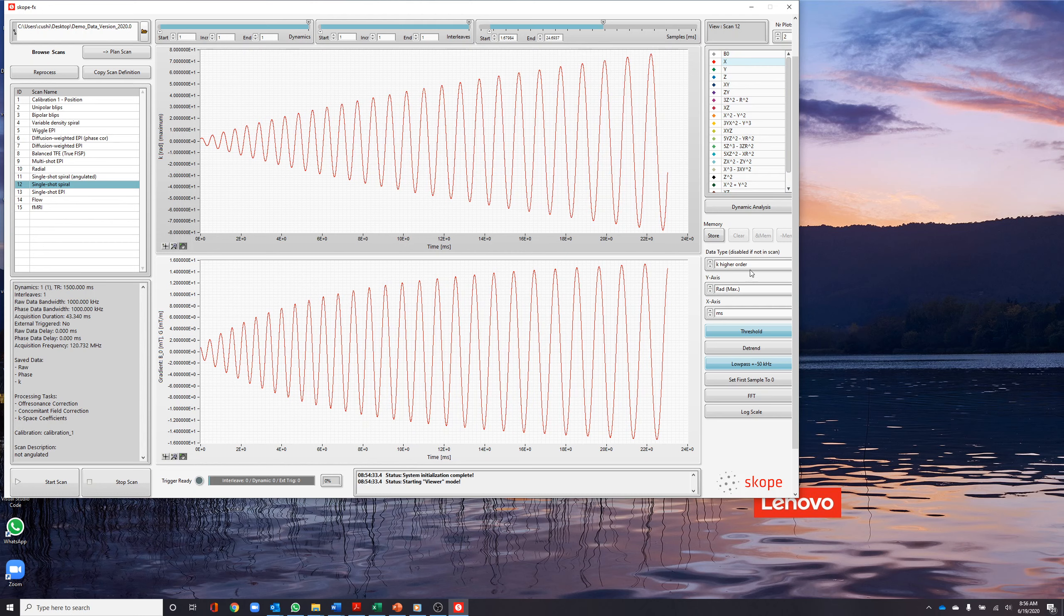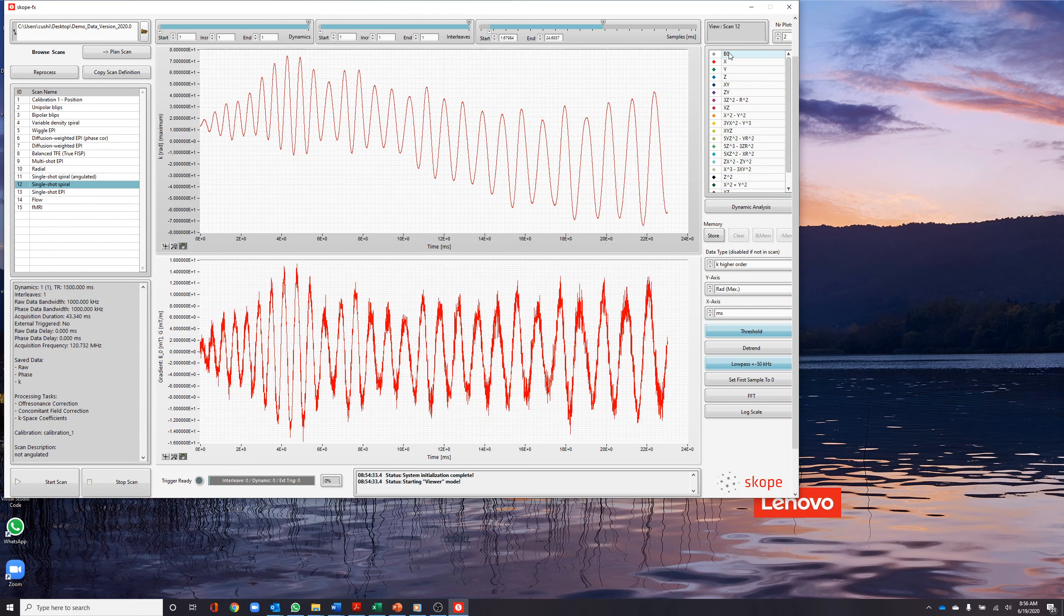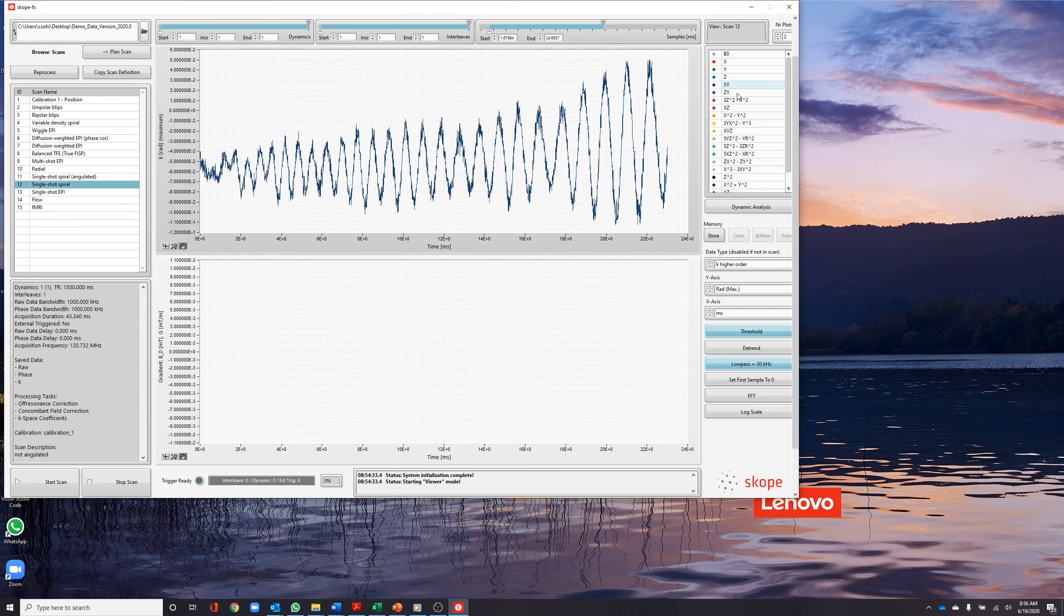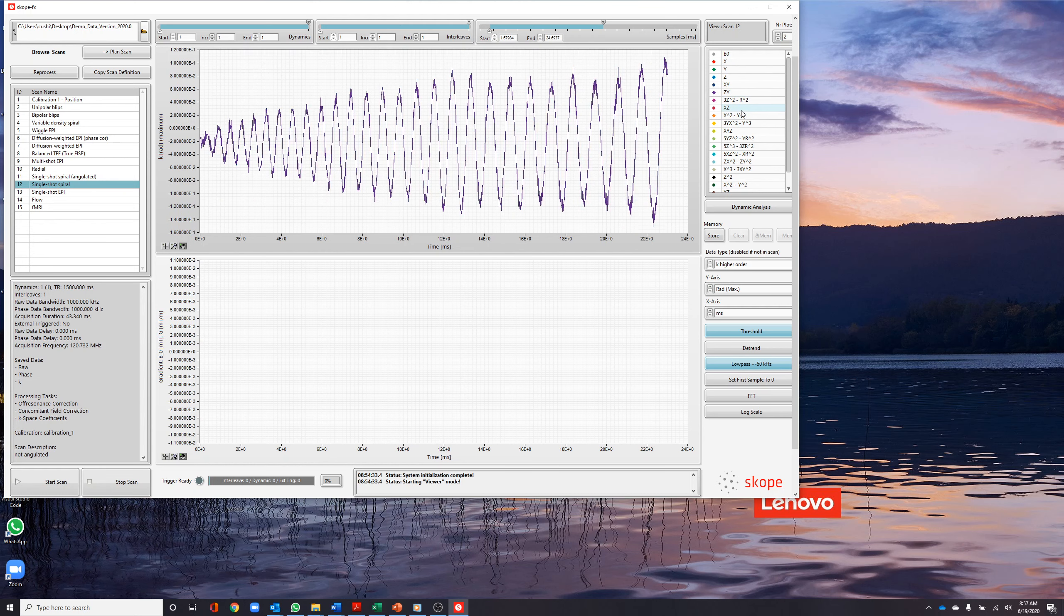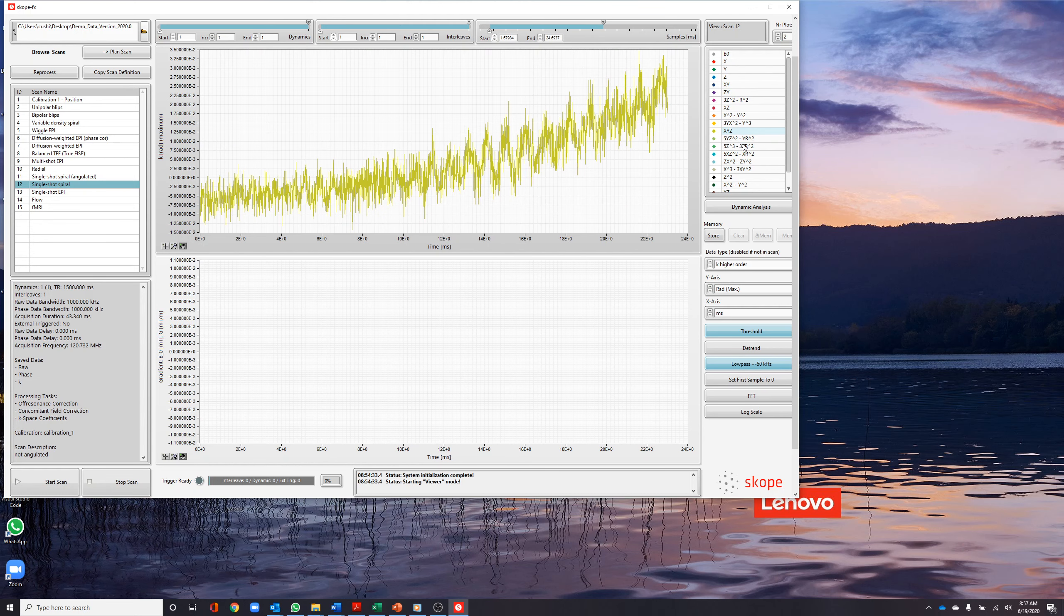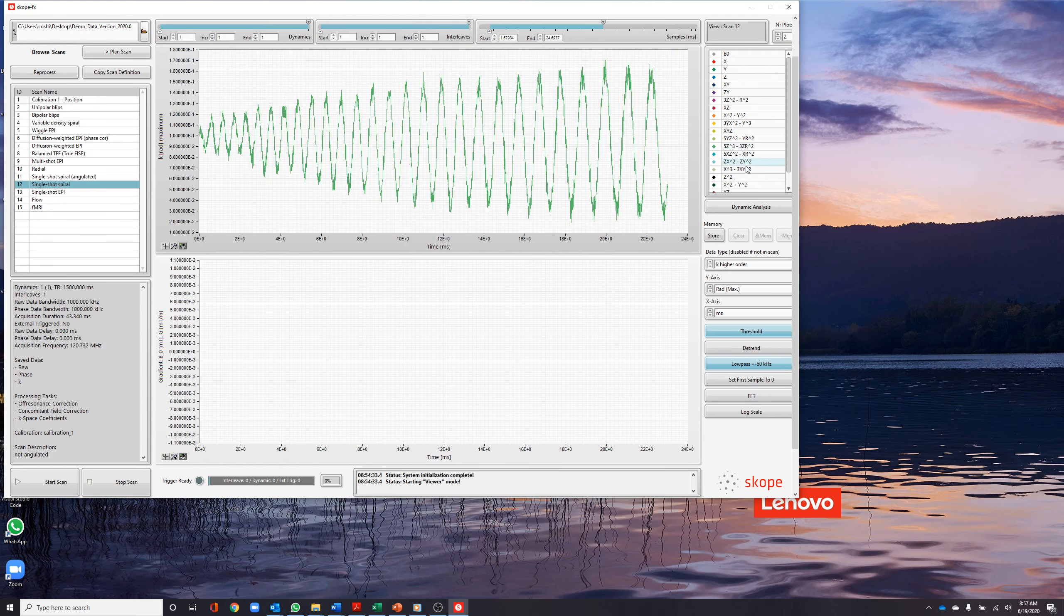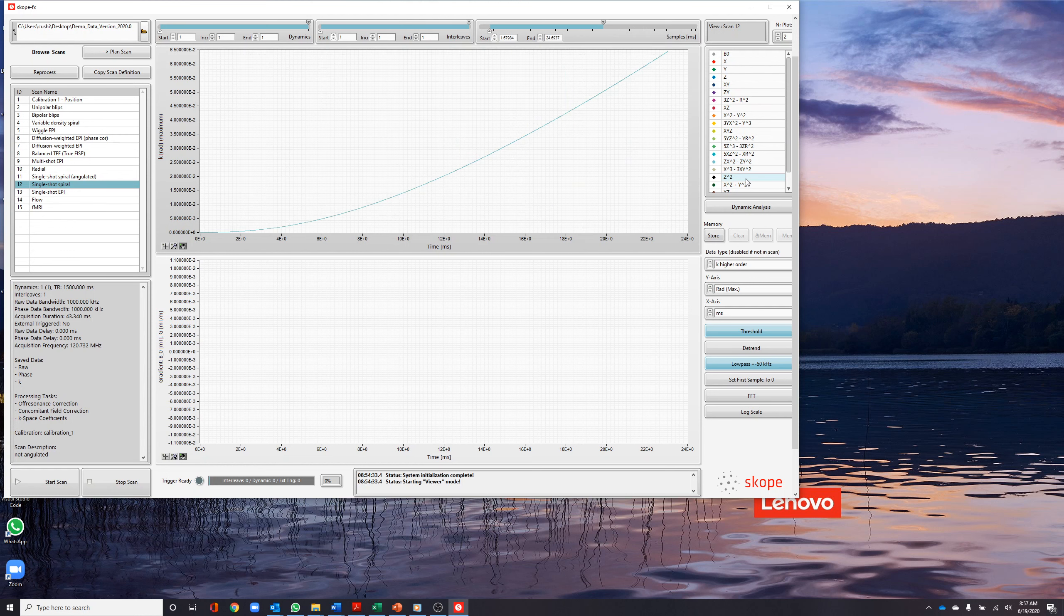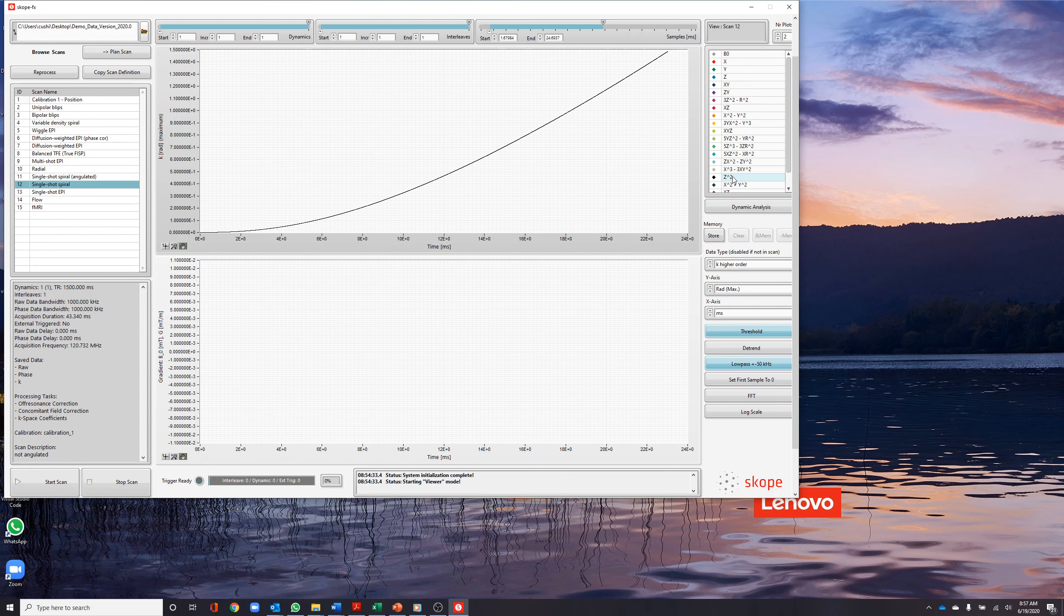B0 field fluctuations can be seen by selecting the B0 channel. Higher-order terms can be visualized by selecting k higher-order. Higher-order terms are a result of concomitant fields that arise when gradients are activated. We can see the magnitude of each of these fields by selecting various channels.